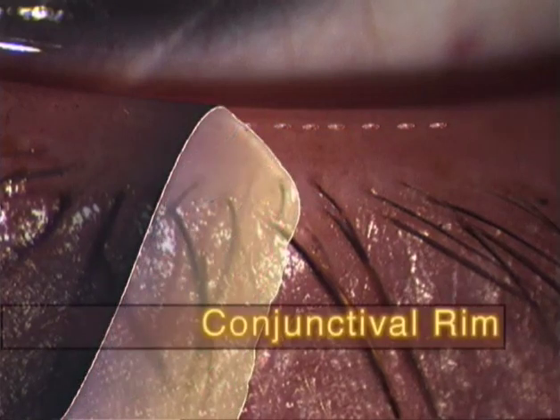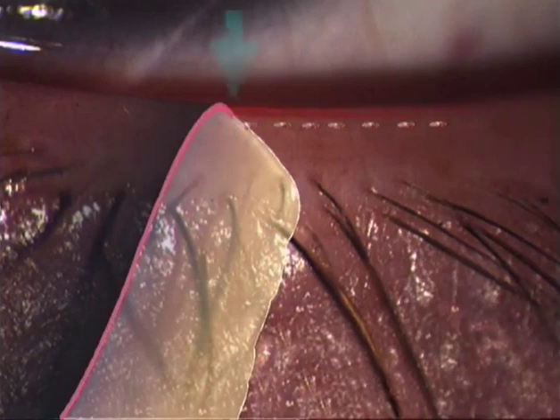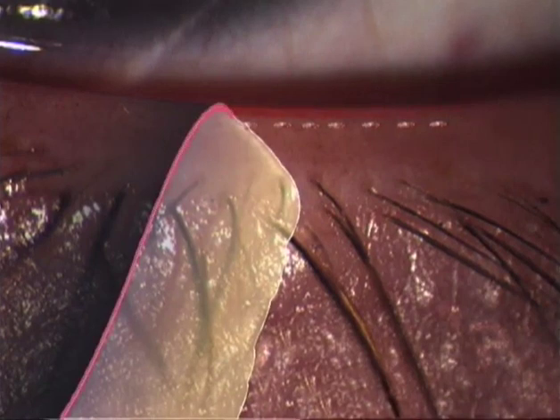The conjunctival part is the part that is wet, and this part is covered by smooth mucous epithelium. This conjunctival rim is an extension of the conjunctiva across the inner edge, so that conjunctival epithelium forms a small strip along the inner lid margin.